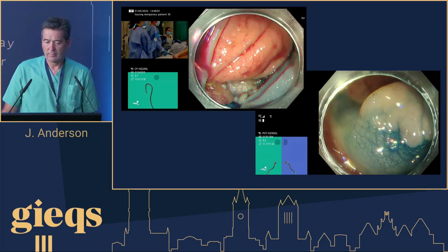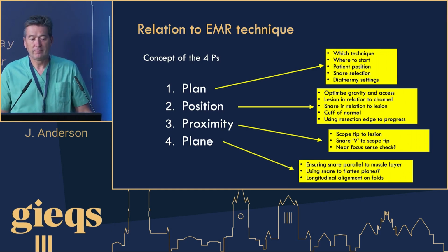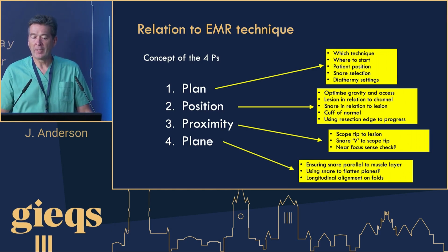And we keep going. So, very basics. Have a plan. Think about your position. Think about the patient's position. Think about the position of the snare. The proximity to the lesion: the closer you are, the more control you've got.